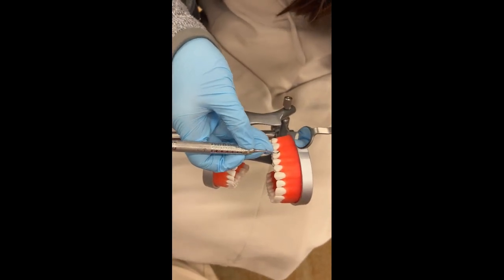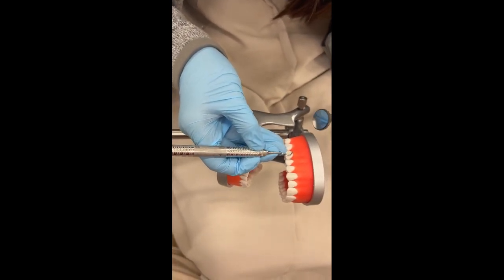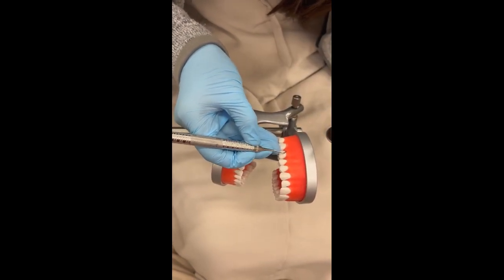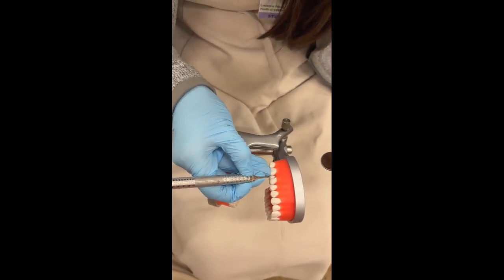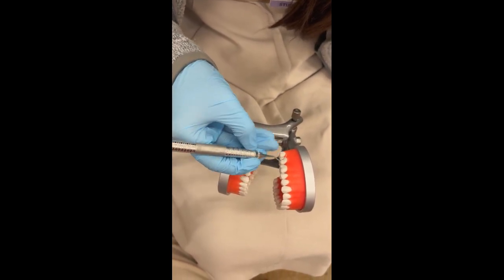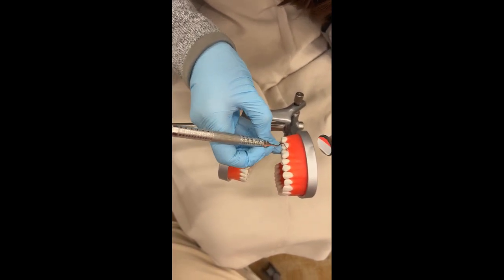To scale the facial surfaces, place the toe of the blade towards the proximal surface with the handle parallel to the tooth. Next, apply strokes to remove deposits from the midline of the tooth to the proximal surface. Then you want to work from canine to canine. Switch working ends and repeat for surfaces away from you. And for lingual surfaces, you repeat all of those steps.